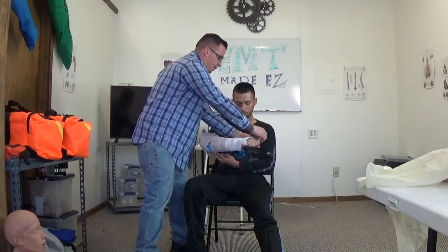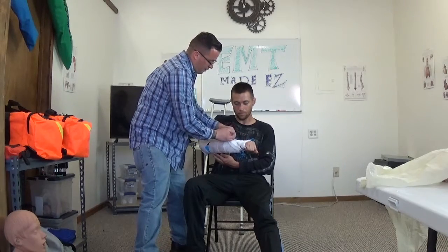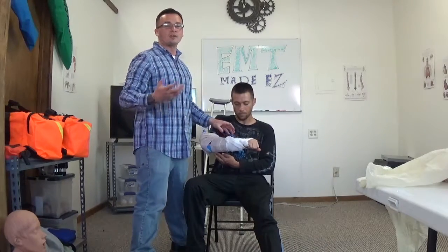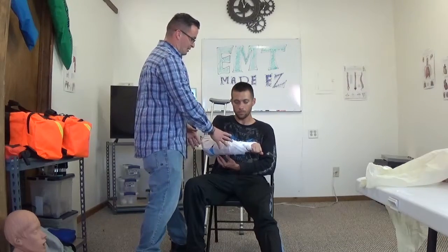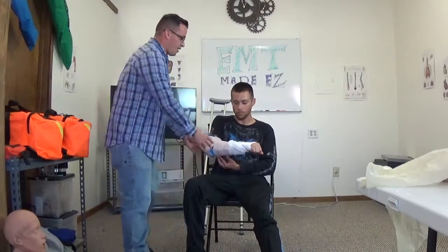You want to make sure you leave no space, then get a radial pulse again — that should be good enough. Like I said, there's preference and there's principle. Principle is what needs to be done; preference is how you do it. This is stabilizing the arm — it may not be as pretty as other people do it, but it's getting the job done.